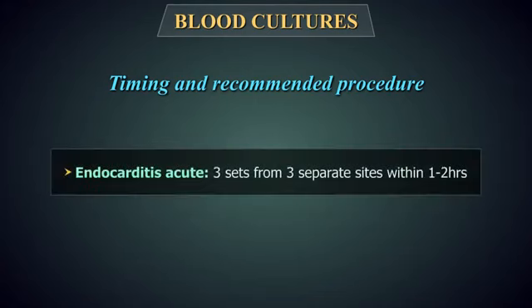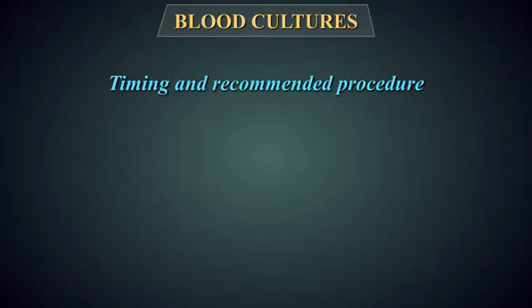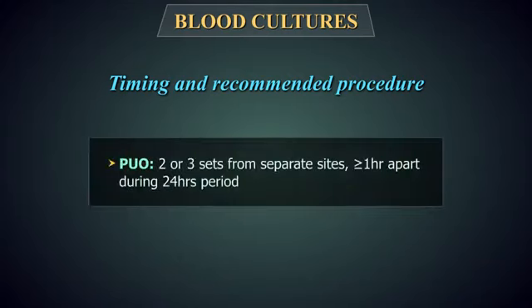Acute endocarditis: 3 sets from 3 separate sites within 1 to 2 hours before antimicrobials, if possible. Pyrexia of unknown origin: 2 or 3 sets from separate sites more than 1 hour apart during a 24-hour period. If negative, at 24 to 48 hours, obtain 2 or 3 more sets.